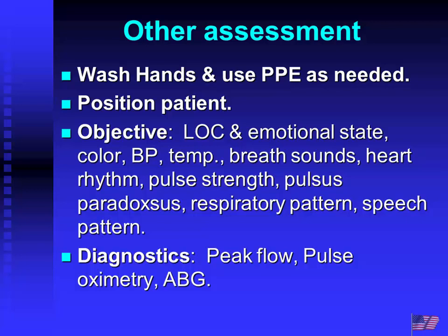Go ahead then and do our process of washing our hands, putting on any personal protective equipment, at least gloves. Make sure the patient's in the proper position, and for a breathing treatment, you want them to be in either a high Fowler's or at least a semi-Fowler's so they can take nice, easy, deep breaths.